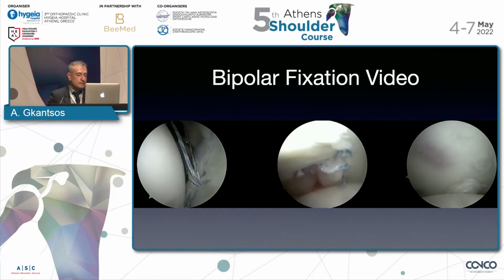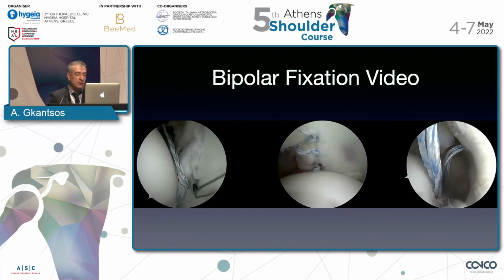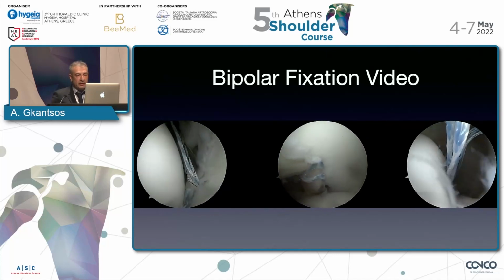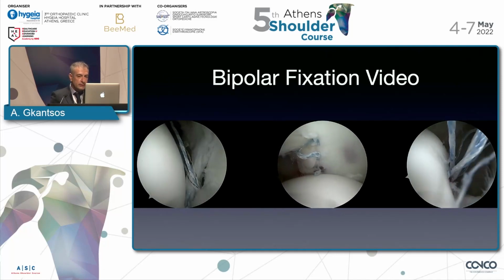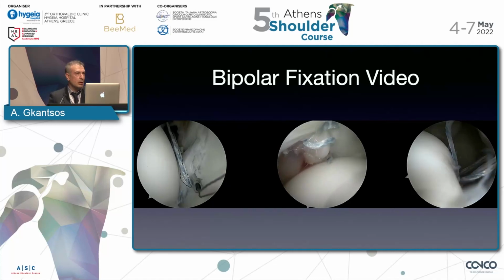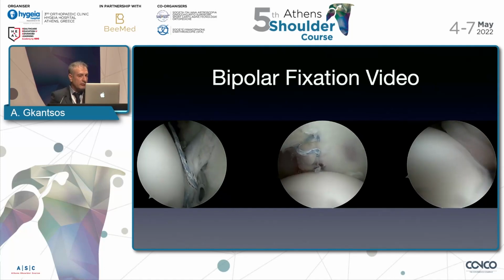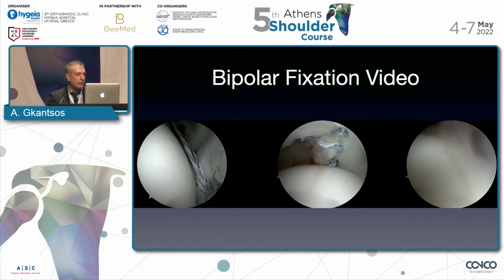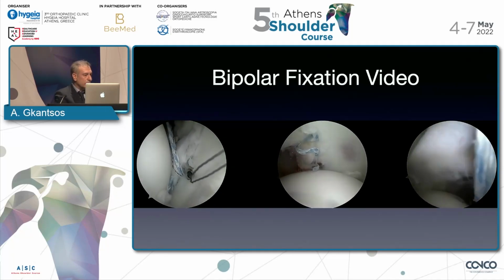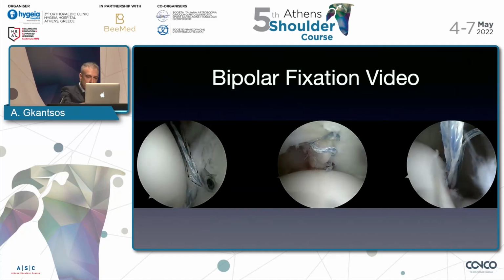And after we finish the labral repair, we check it from the superior portal, and then step by step, we do the tensioning of our remplissage anchors. We use the knotless anchors, as we said, and always put them in the center of the lesion, maybe 3 or 5 millimeters from the articular surface, because if you put it just on the articular surface, you drape across the lesion and do not tag the infraspinatus into the lesion. And I think it's a big mistake.